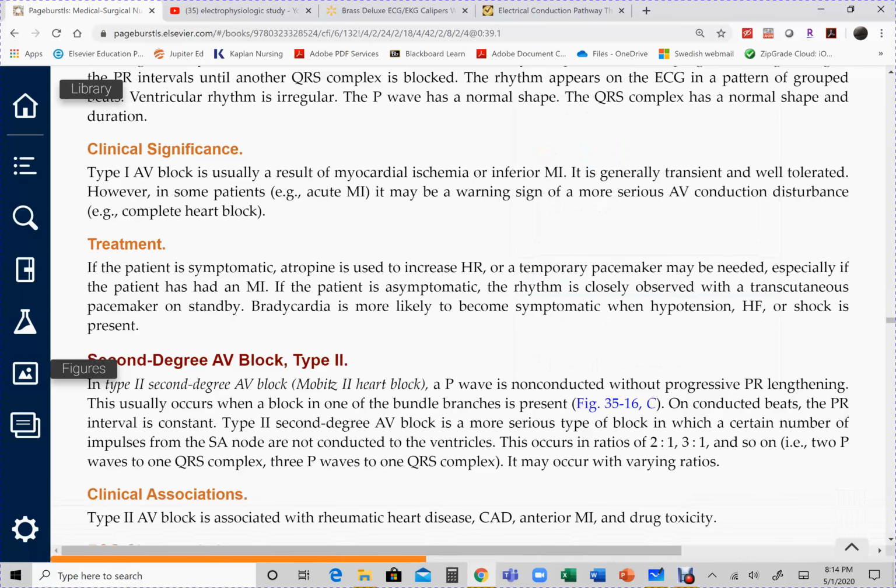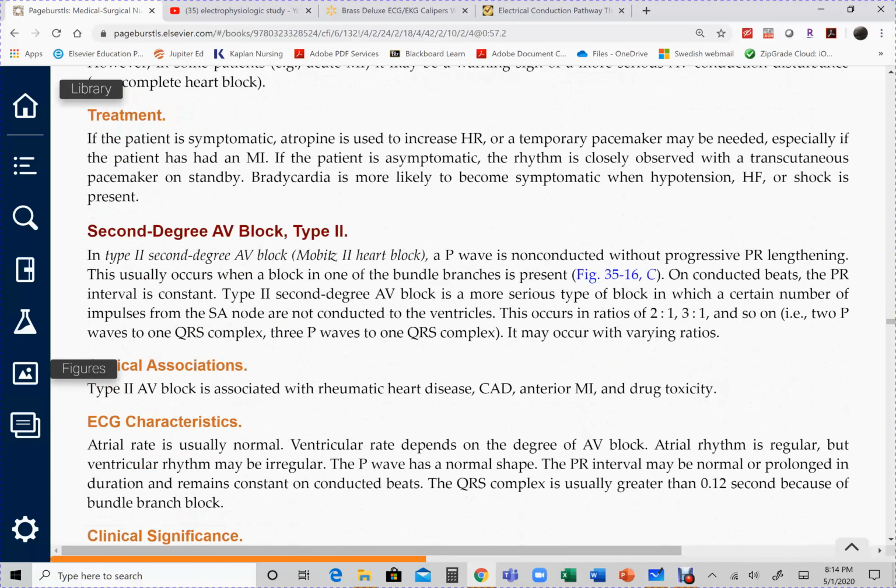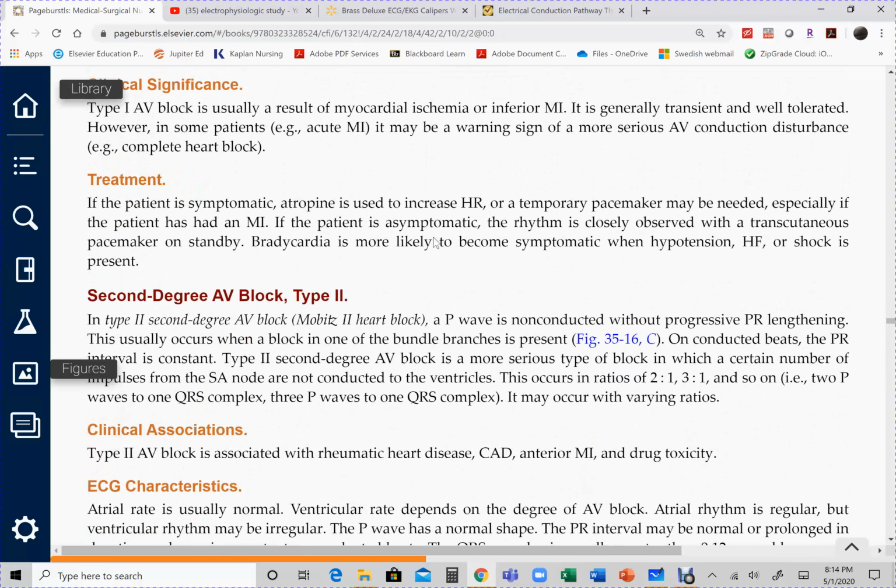Temporary, there are two forms. We have transcutaneous, so they're just pads, kind of like an AED. We put the pacer pads on the patient's skin, attached to the external pacer, and voila. There's also a transvenous pacemaker. In this one the wires are inside the heart, in the ventricle and on the SA node. It's put in the atrium and the ventricle, both on the right.